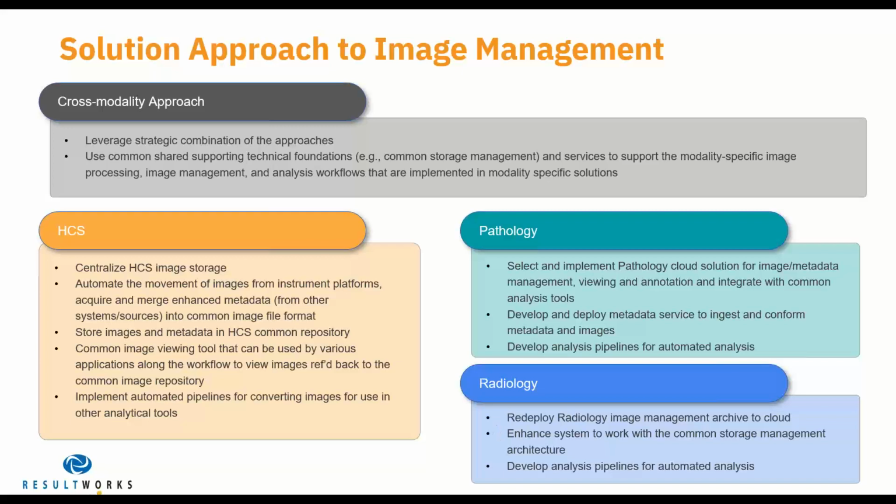And on the radiology side, we were able to redeploy the solution that was already in play on a local basis into a cloud-based environment for scalability. We did some enhancements to that system to work with a common storage architecture, and again, develop some analysis pipelines for automating the analysis process. So that's where we wound up in each of those areas.